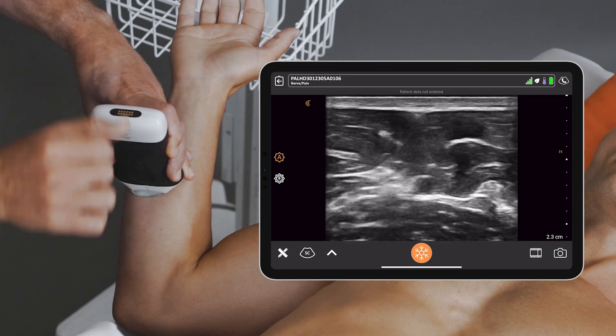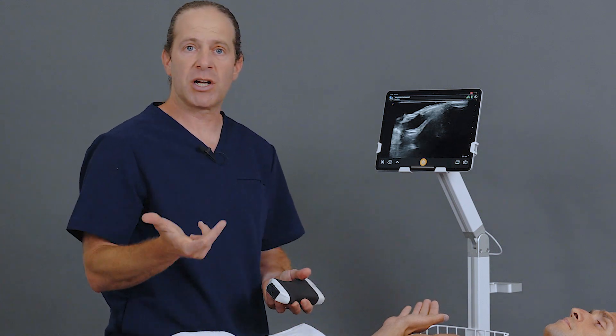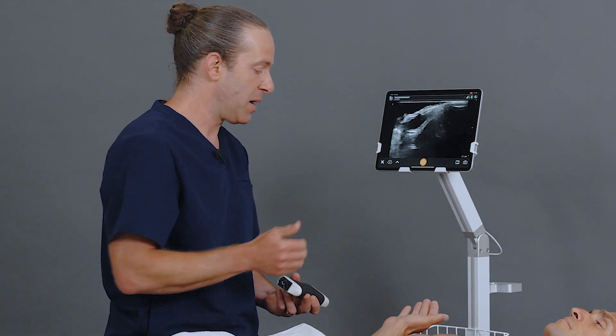I'll pop a donut of anesthesia around the ulnar nerve, and within minutes the patient will start to have anesthesia of the ulnar aspect of the hand, either to facilitate a reduction of a boxer's fracture or other procedures.